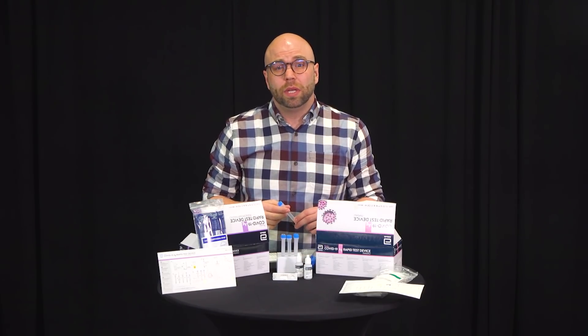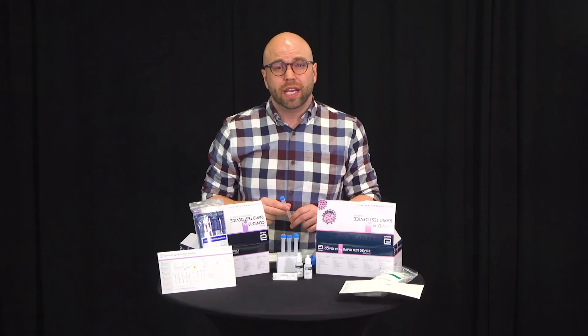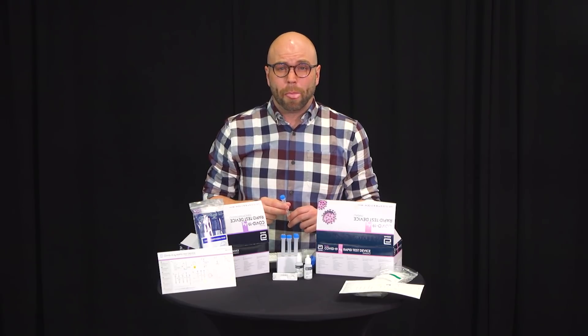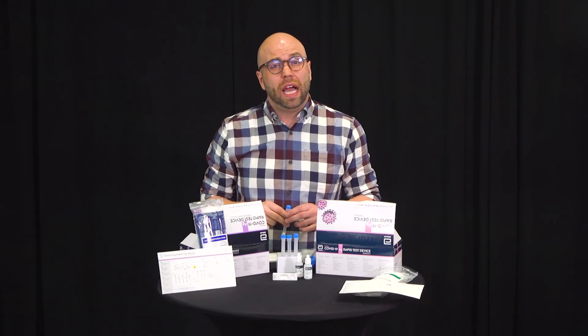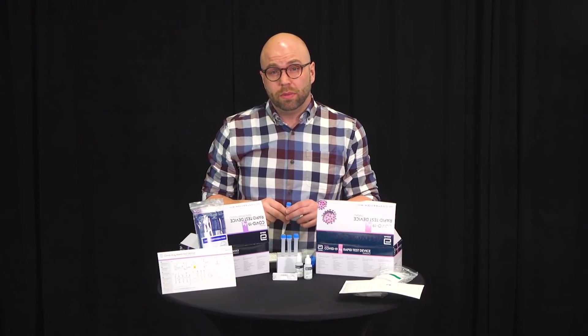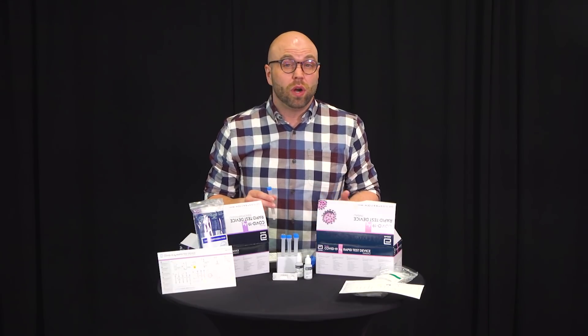In your workplace, the test will be done under the supervision of someone who is trained on this process to ensure the sample collection and the test is done properly. However, for this video, we're showing you how a self-collection works. First, we'll demonstrate how to do a swab using a nasal swab, and then we will show you how to do a nasopharyngeal or NP swab.